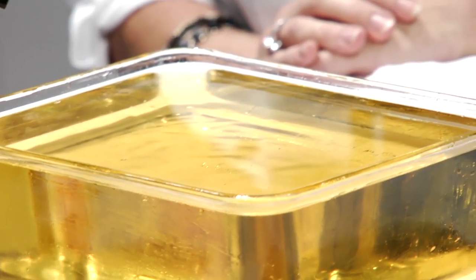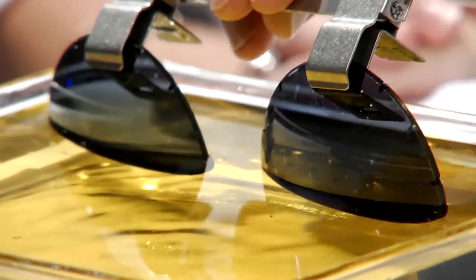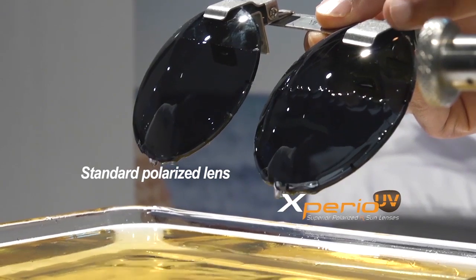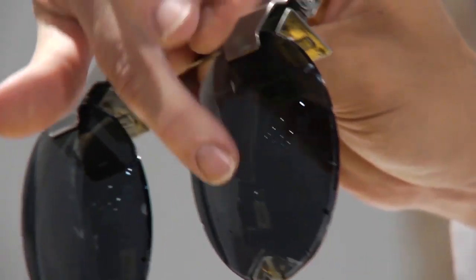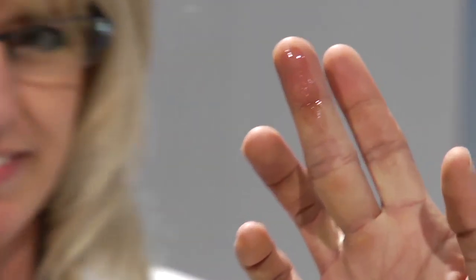We have our standard polarized and we have our Xperio UV. I'm going to dip it in the oil. So now I'm pulling this out — that oil is sliding right off. It's literally retreating right off the surface of our lens. Hey, why don't you feel this right here in the middle? It's pretty good, huh? What about the other side? Let's show the grease on our hands on the other side.